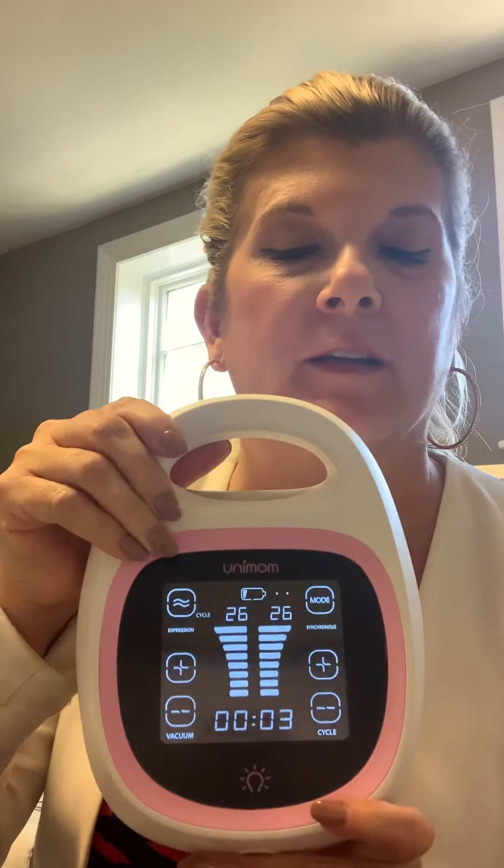It is hospital strength, and this is your on/off button right here — you hold it until it goes on. Then you've got your expression mode right here where it says massage, and it switches between massage and expression.